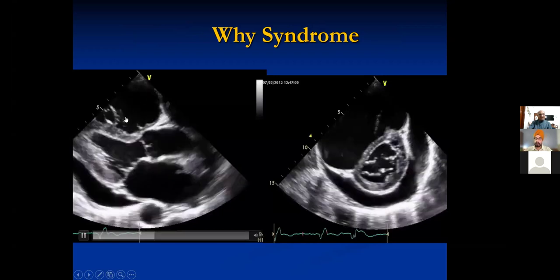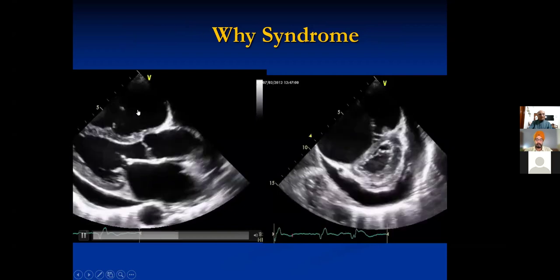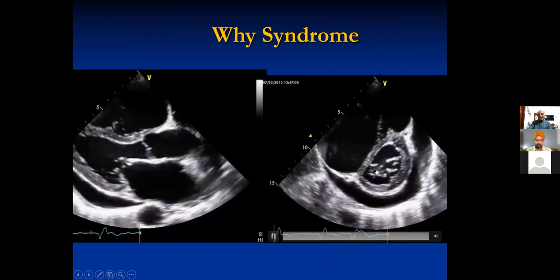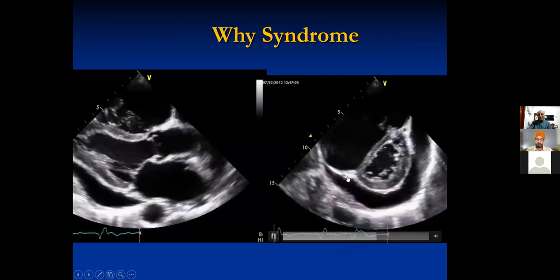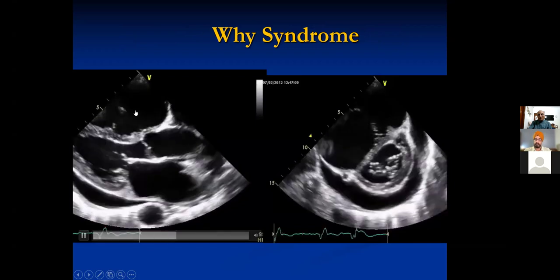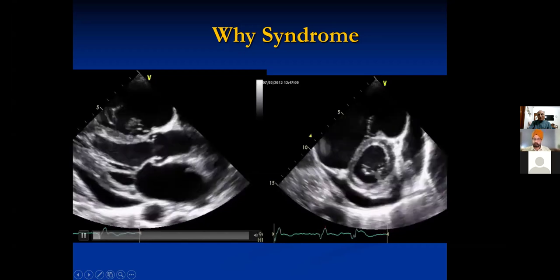Then you see this patient came, now he had a pericardial effusion, but why is the RV enlarged? Again, you see, there is diastolic flattening of the interventricular septum. Why is this separate pathology? We could see that the patient had an anomaly. These are aspects in mitral stenosis, and I'm sure this can be discussed later on.